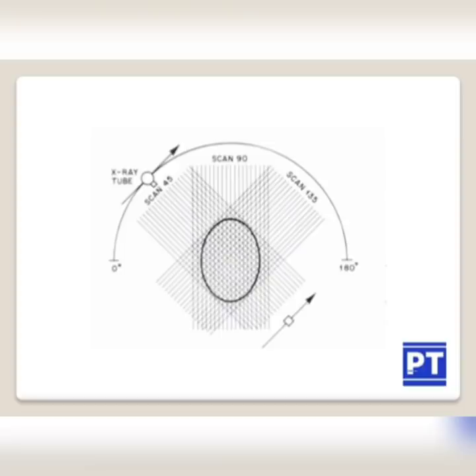So after completing 180 linear movements, the gantry rotated 1 degree. Thus, the total rotatory motion encompassed a 180 degree semicircle. The axis of rotation passed through the center of the patient's head, as you can see in this image.